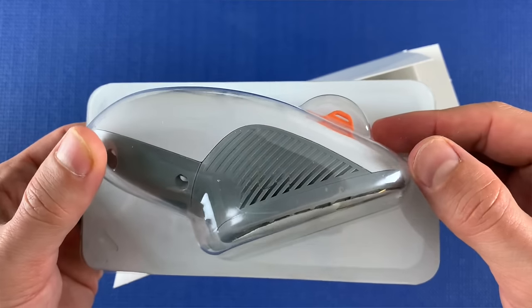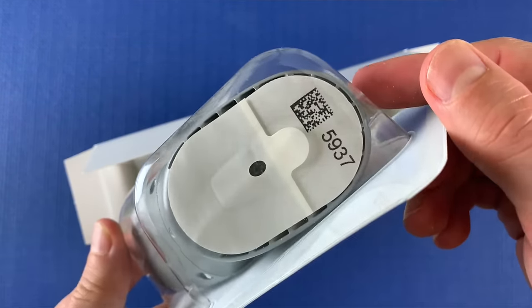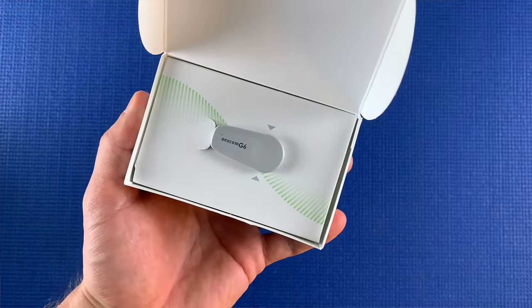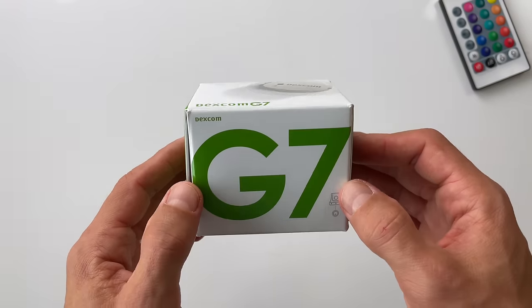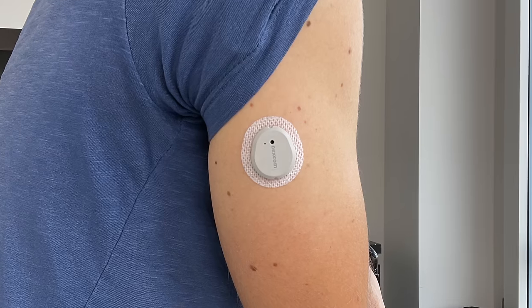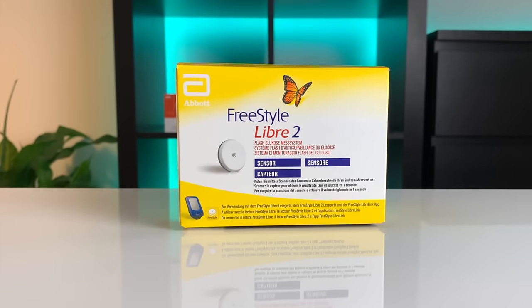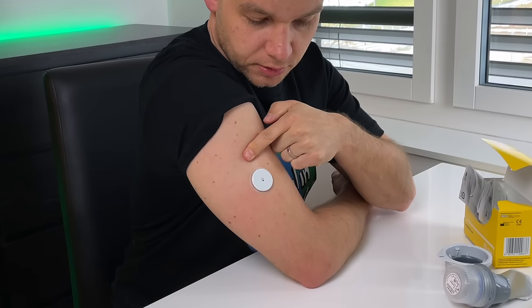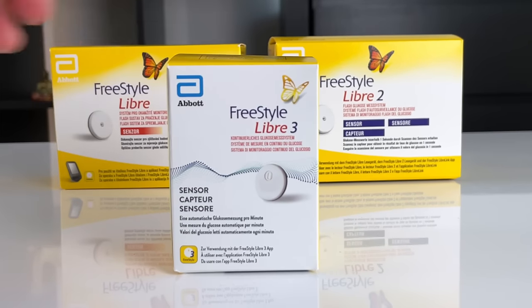Both companies are working on integrating Dexcom G7 and Freestyle Libre 2 in late 2023 or early 2024, with Freestyle Libre 3 expected to follow. Tandem seems slightly ahead of Insulet on integrating these additional sensors so they might launch them earlier, but we'll see.